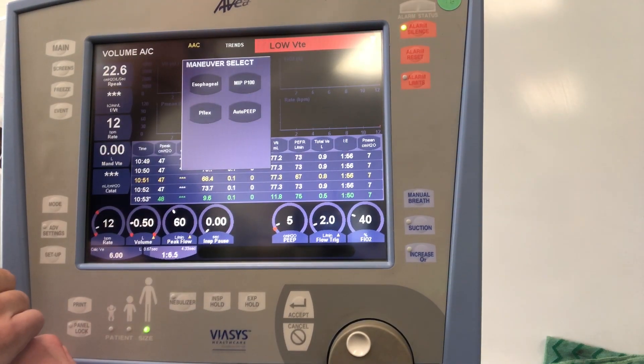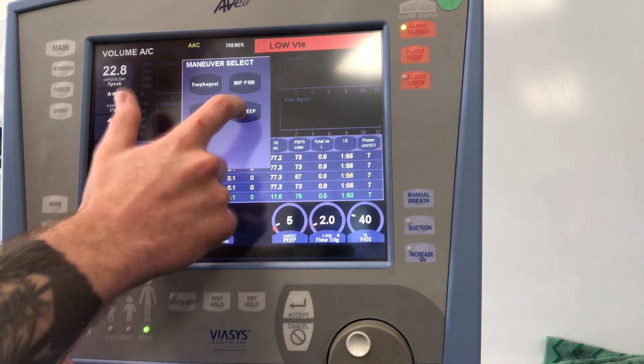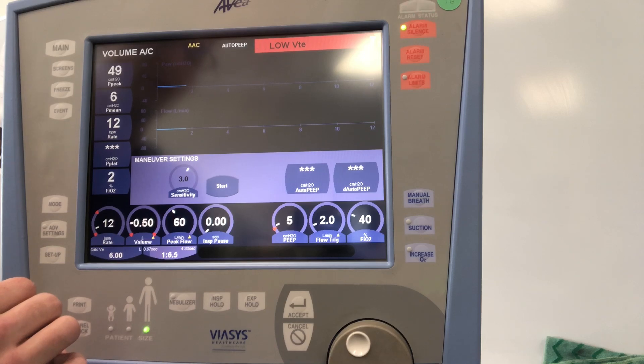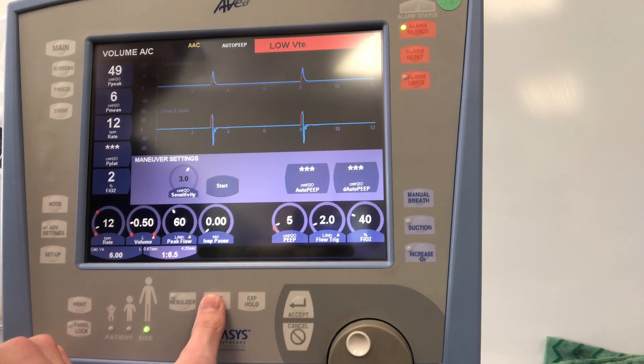Under Maneuvers, we have the ability to do esophageal monitoring, NIP/P100 — which likely won't be applicable — as well as PFLEX. We can also automatically measure auto-PEEP, however we recommend just doing an expiratory hold. The expiratory hold button is down here; you can hold it for up to about 20 seconds. Inspiratory hold is right next to it.